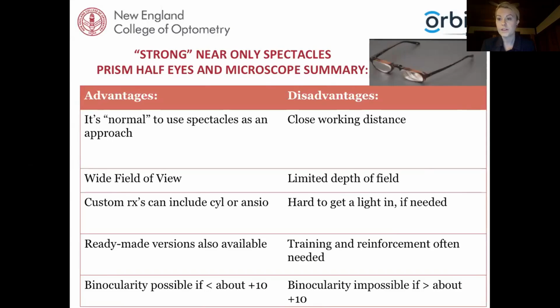The working distance, or the focal point where the patient has to hold the page to read, is a lot closer now. And there's much more limited depth of field, so a limited range in which the patient is in focus. But this does provide a very wide field of view for the patient because we are putting the magnification required at the spectacle plane.